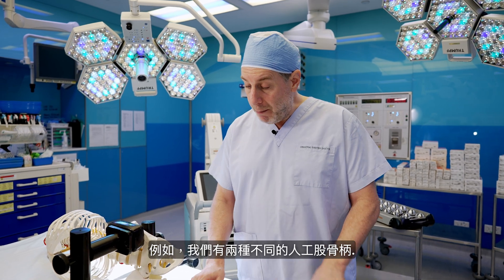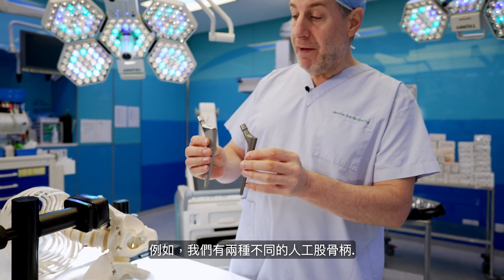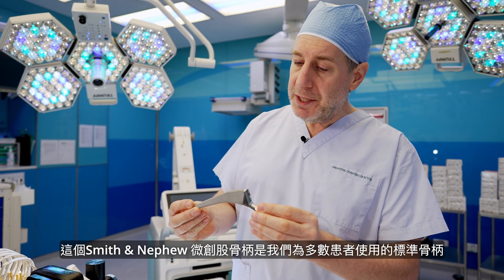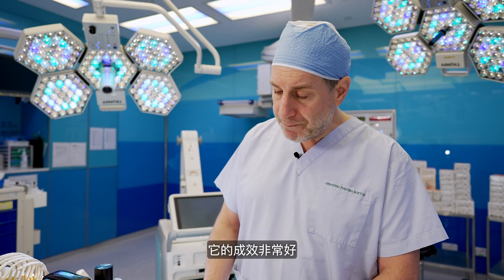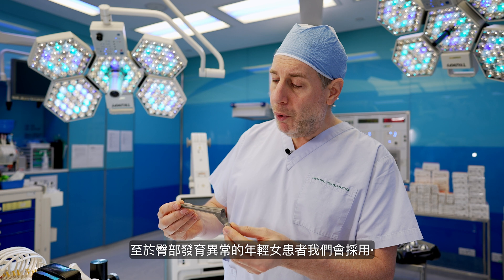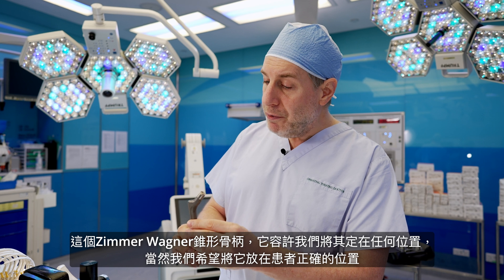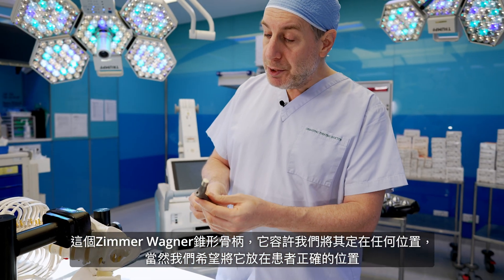For example, we have two different types of femoral stem. This Smith & Nephew polar stem is the standard stem that we use for the vast majority of patients — it works extremely well. But for patients whose hips did not form normally, mostly young women, this Zimmer-Wagner cone stem allows us to position it in any position we want.